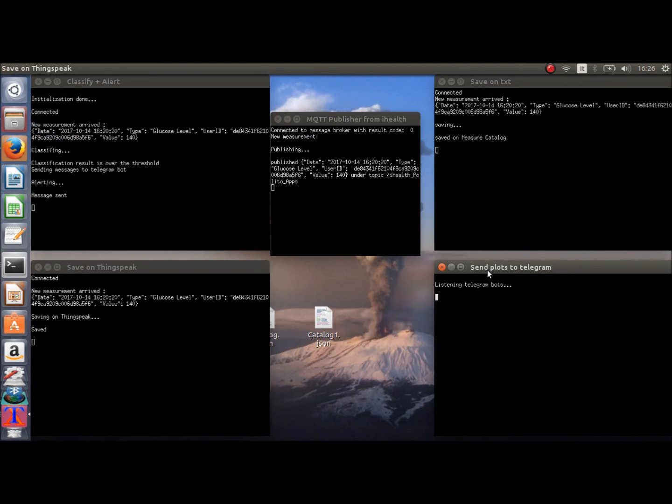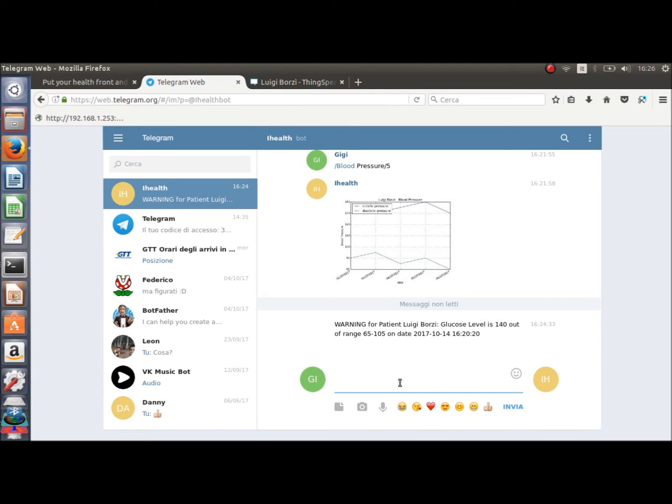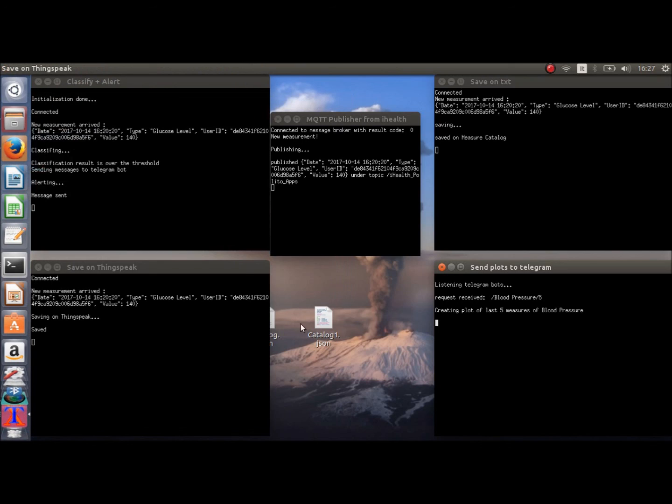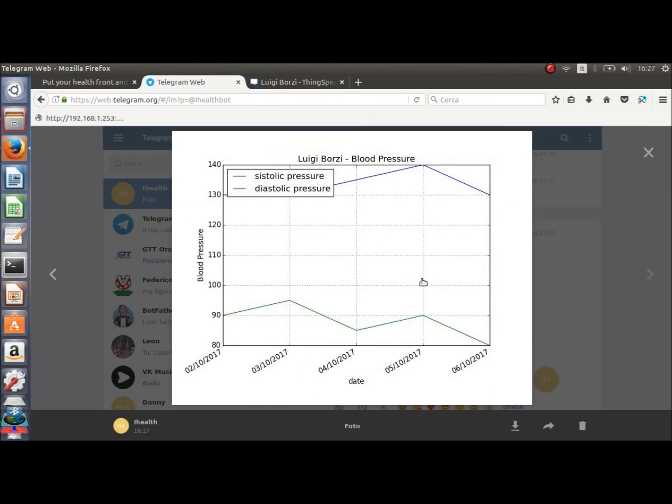The last microservice, called send-plot-to-Telegram, listens to all patient Telegram bots and, if a request is received from a bot, it creates a measurement plot and sends it back to it. Reaching the Telegram account, we can send a request to the program in the following format: kind of measure, number of measurements. The plot is sent to the Telegram bot, and that's it.